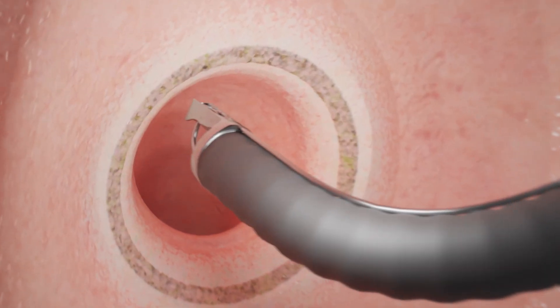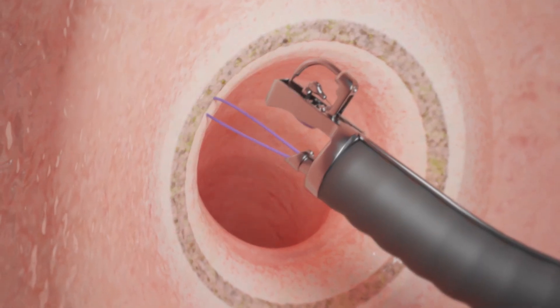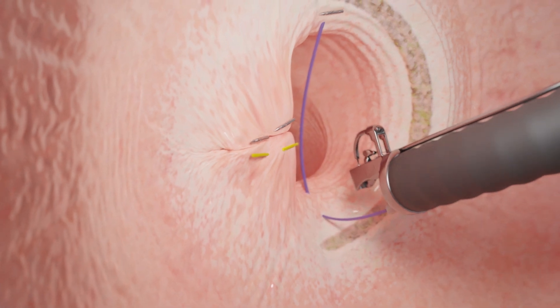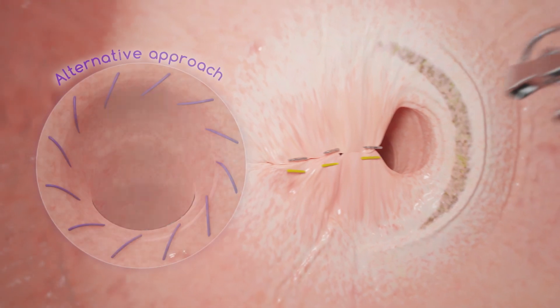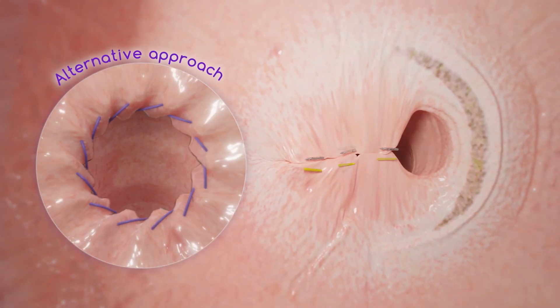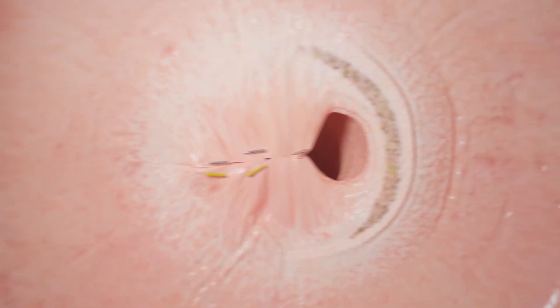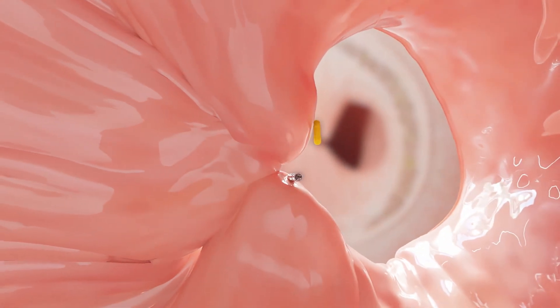Using the Apollo Revised System, the doctor may place a few stitches to tighten the outlet, or may sew completely around the outlet to tighten it into a smaller size. If needed, the doctor may use one to two stitches to re-tighten the stomach pouch as well.